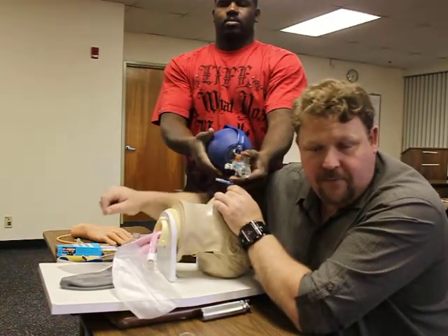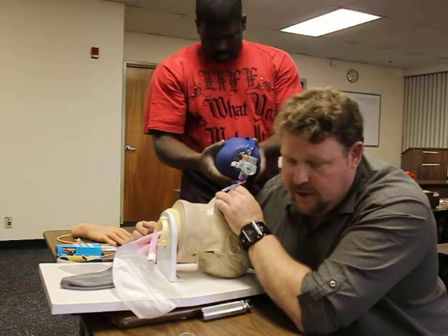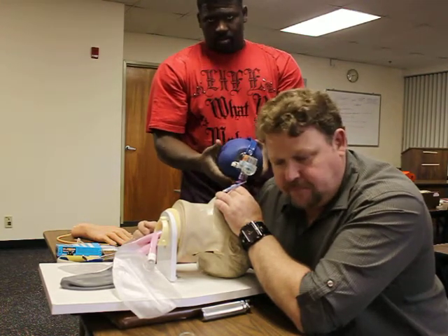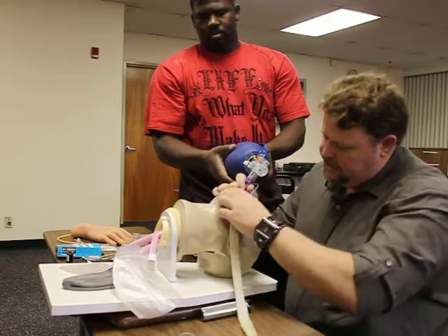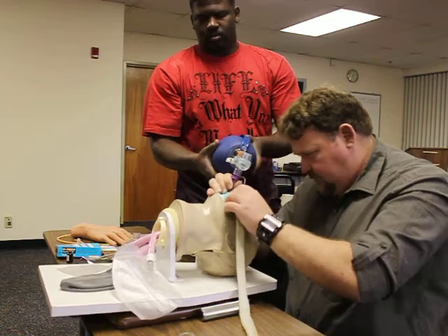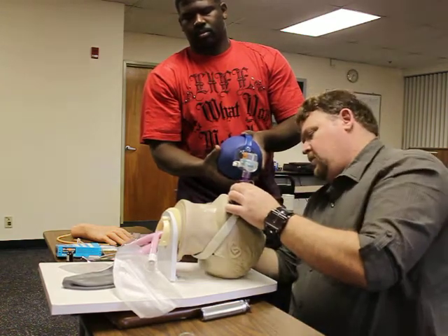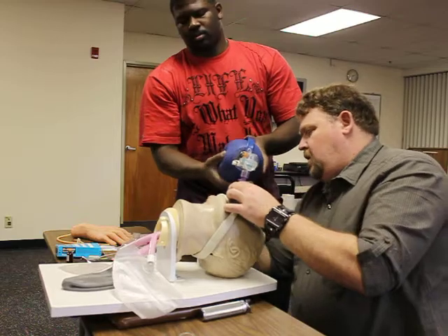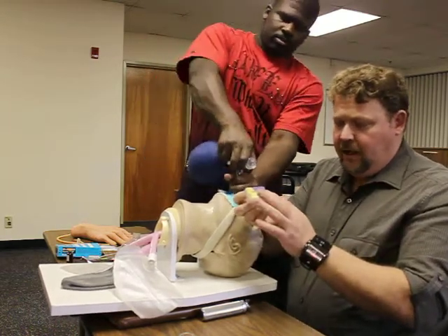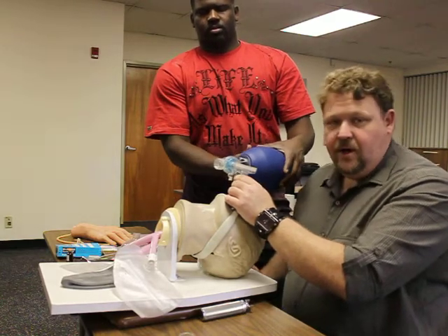I'm going to go ahead and listen bilaterally for lung sounds and also listen over the epigastrium. To confirm appropriate ventilation volumes, I'll listen and note good lung sounds as well as good chest rise and fall. I'm going to secure my tube with a commercial device, then attach my tube to capnography on my cardiac monitor. Or I can utilize my colorimetric device — gold being golden means I've got CO2, purple is poopy meaning I'm not in the trachea. I do note that it stays gold.